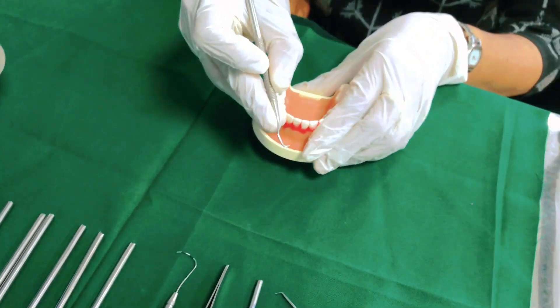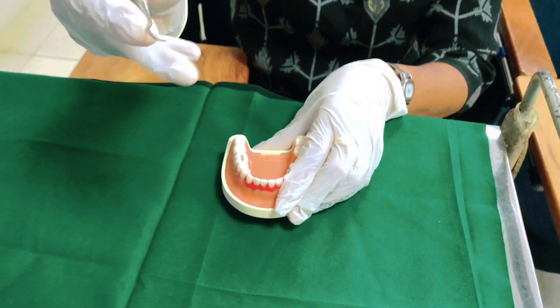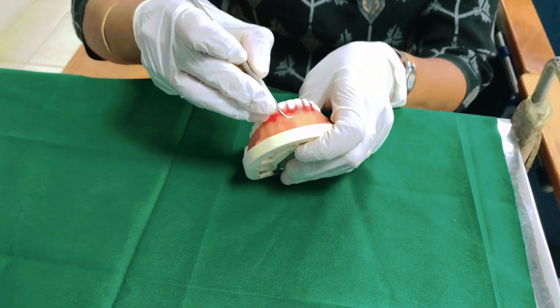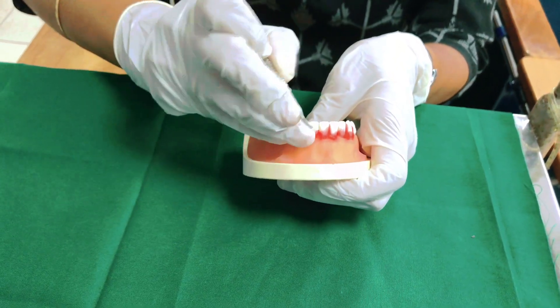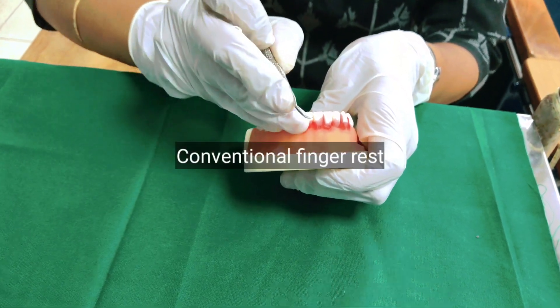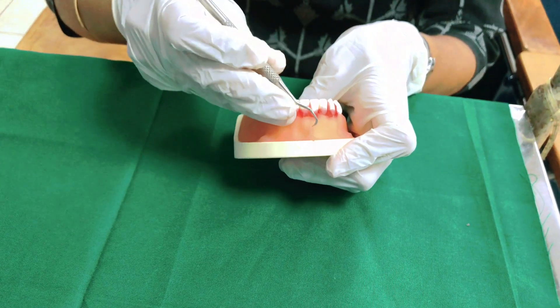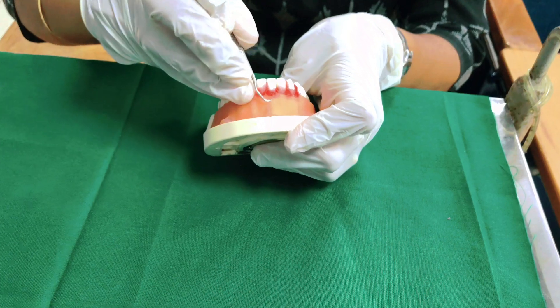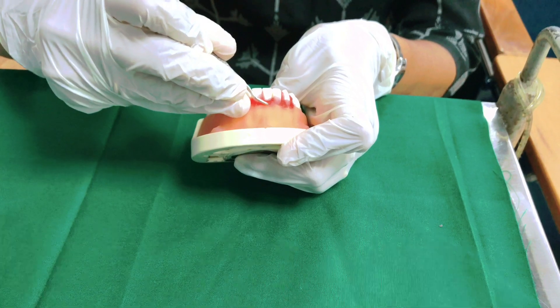For instrument stabilization, you actually stabilize the instrument with your ring finger and little finger. For example, if you are going to do scaling on this tooth, the ring finger needs to cup onto the neighboring teeth — this is called a conventional finger rest. Then hold your instrument well and try to activate it by removing the calculus.